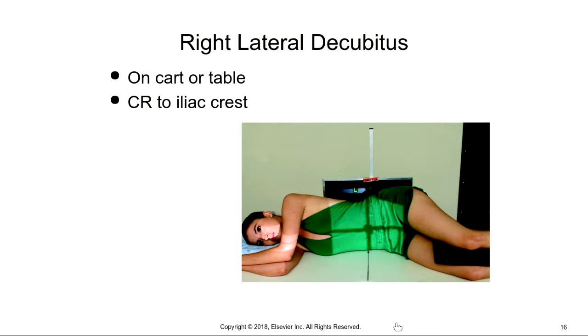So for the decubes, we start off with those. Notice we use a 14 by 17, however would work for the patient. So this particular patient would fit on one 14 by 17 lengthwise, and that's how that image receptor is set to the patient. If your patient required two 14 by 17s crosswise, then you would have to take two 14 by 17s crosswise for the decubitus view.